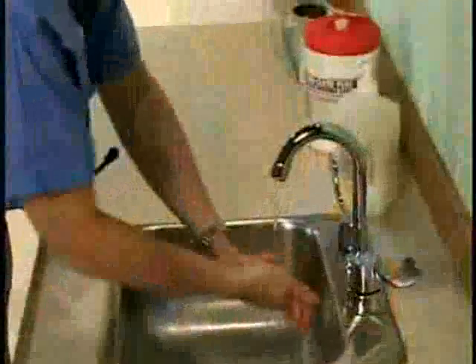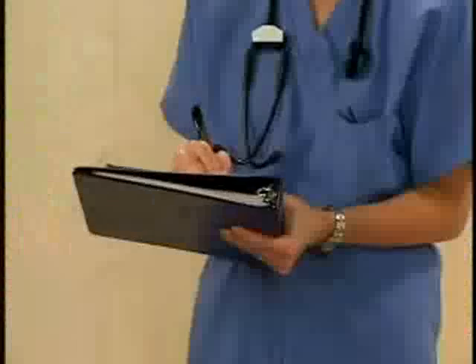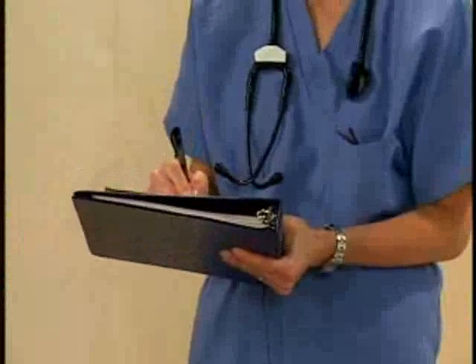Remove your gloves and wash your hands. Record the medication administration and your observations.